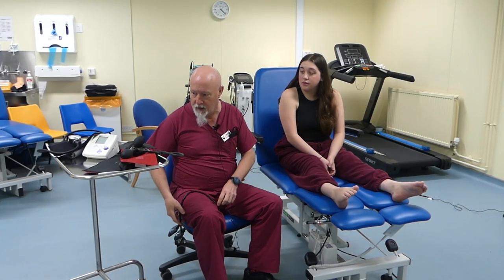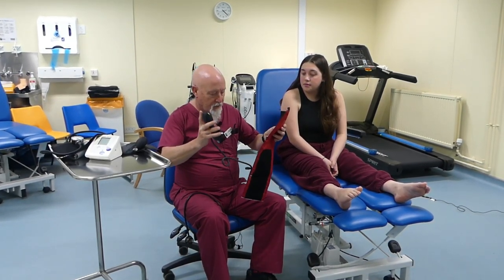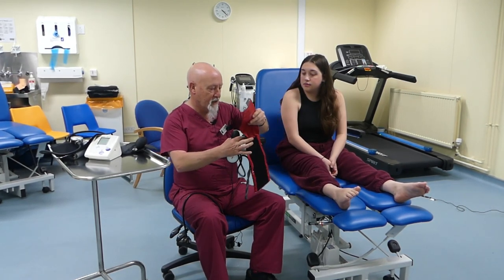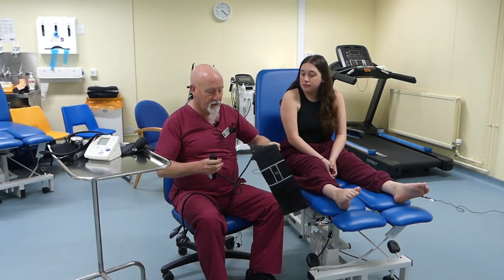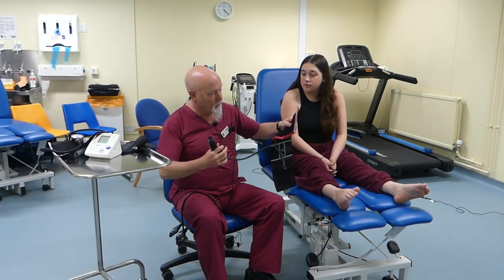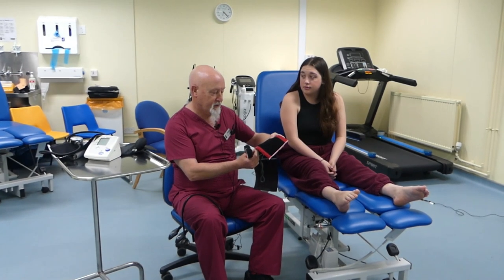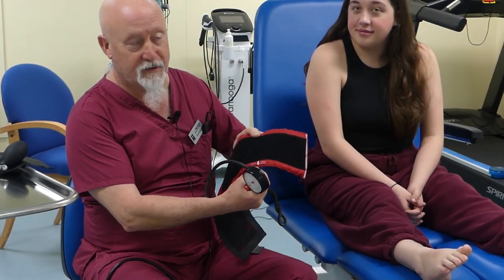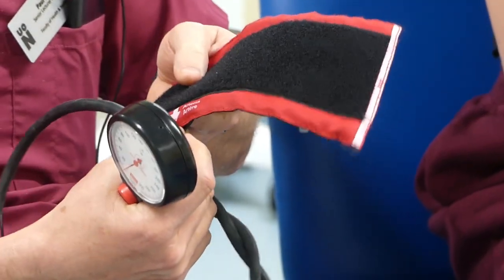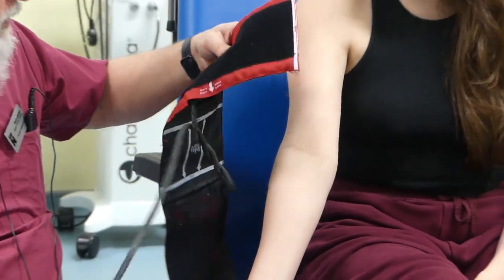That's the stethoscope part of the equation. Then we've got sphygmomanometers, of which there are a couple of different kinds. The key is that you get the inflatable bell of the cuff against the patient. Sphygmomanometers will actually show you where to place the artery — there'll be a marking, here it says 'arteria' in Italian, and also in English. You point that towards the artery you're going to be occluding, in this case the brachial artery.